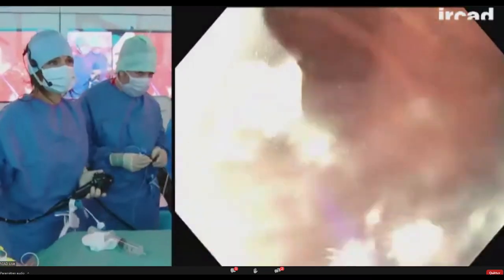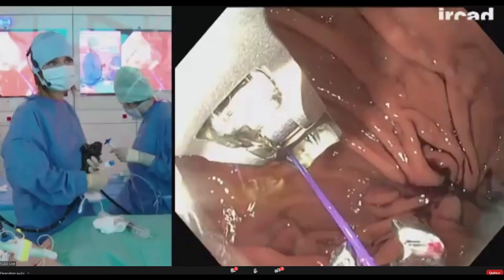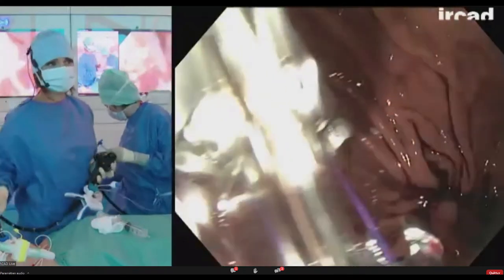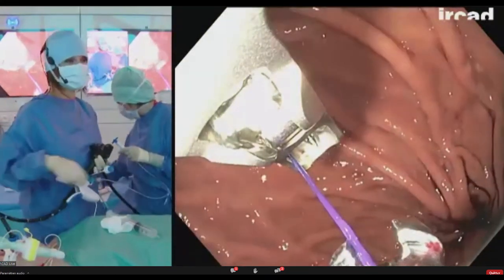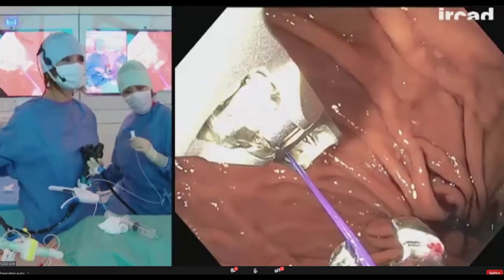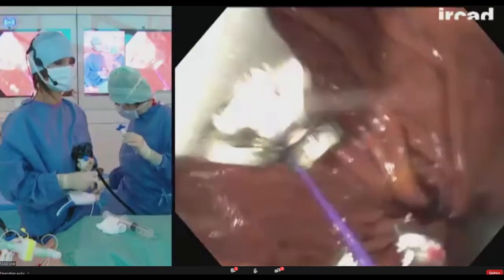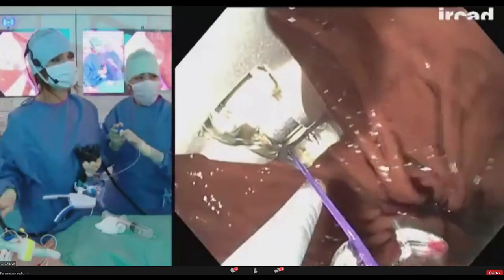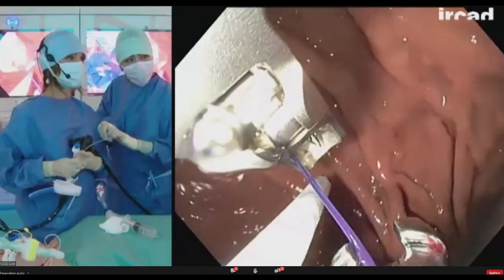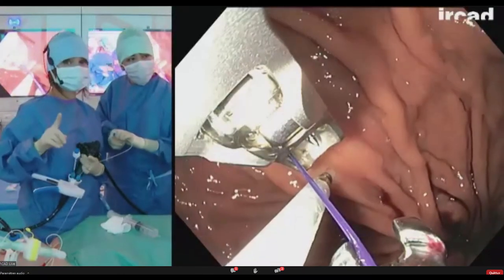Actually, we did a study that was just published this year, and we systematically check all our ESG at 6 months, 12 months, and 2 years. The study we published is on the 1 year endoscopic follow-up. What we could see is that at 1 year, only 6.9% of patients had an open gastroplasty. The rest had either an intact gastroplasty with all the sutures present, or a partially intact gastroplasty where one or two sutures were a little bit relaxed. But as Manuel was saying, it is the lack of distensibility that the serosa to serosa apposition induces that is responsible for the restriction.